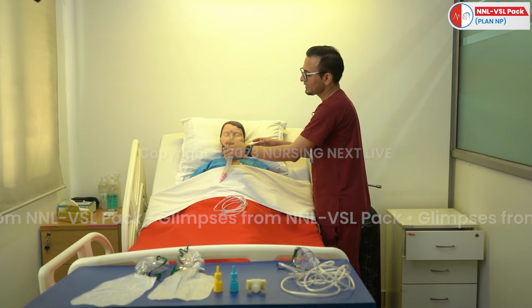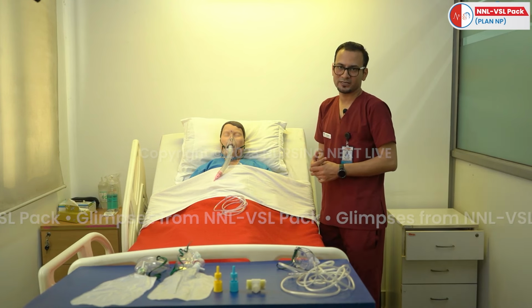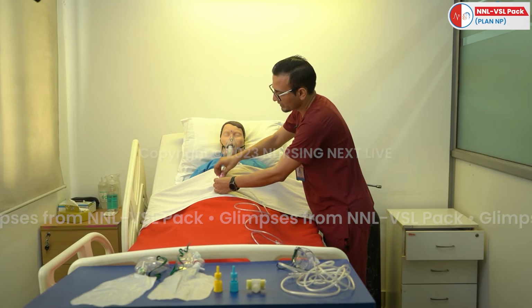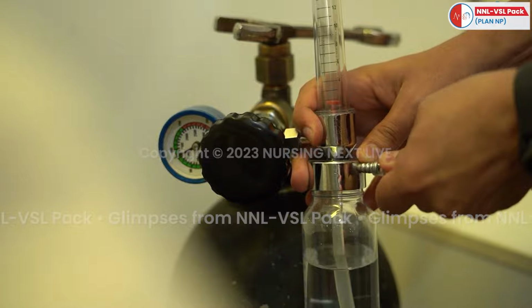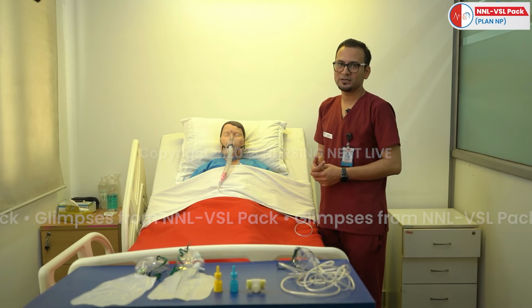This mask is basically a medical device, and it is widely used for patients who are on controlled oxygen concentration. In this mask we are going to attach the tubing. One end of the tubing we are going to attach to the venturi, and the other end of the tubing we are going to attach to the oxygen cylinder, and with the help of this we can deliver the exact amount of oxygenation to the patient.